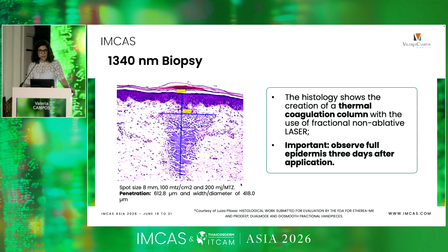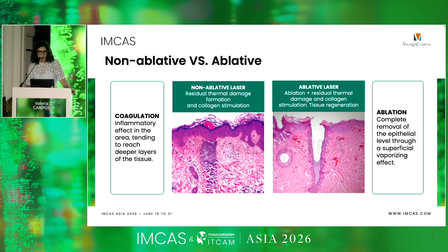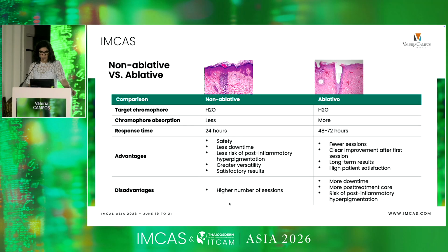And if we look here, there is something we sometimes don't realize when using a non-ablative laser. Yesterday, someone asked me in another talk if it was capable of removing vessels. It's not absorbed by hemoglobin but by water, but you produce this collagen, so yes, you can reduce them. Of course, it's not the main purpose of this laser. We can work in a gentle way, using less energy, but when you want to go deeper, you use higher energy. And this is the kind of coagulation you produce. So yes, you can use it for drug delivery as well.